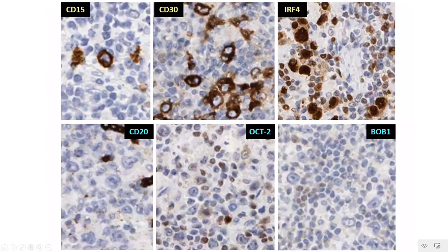The immunophenotype in this particular case shows a characteristic expression as expected in the case of classic Hodgkin lymphoma. So the cells are positive for CD15 and CD30. They strongly express the post-germinal marker MUM1 IRF4. They are negative for CD20 as well as for B-cell transcription factors like OCT2 and BOB1. So this is a syncytial variant or a cellular phase of classic Hodgkin lymphoma of the nodular sclerosis type.